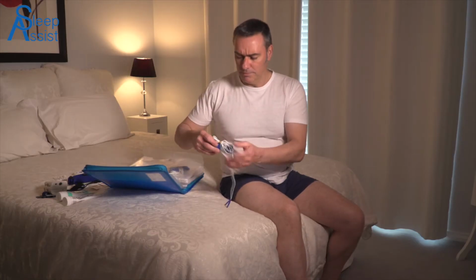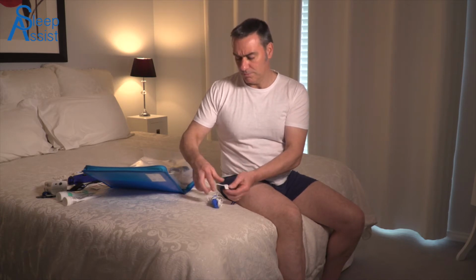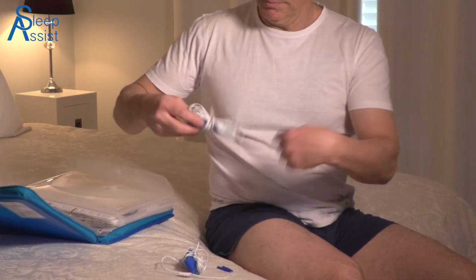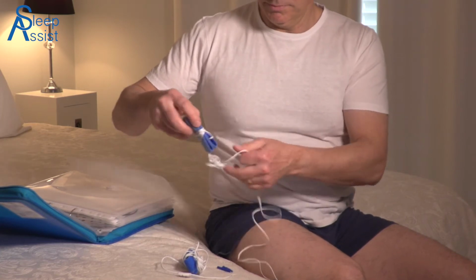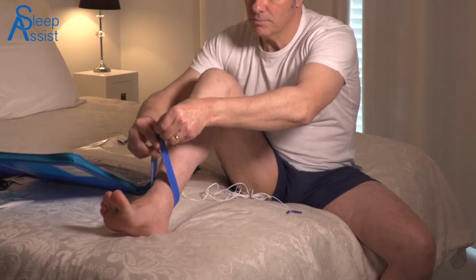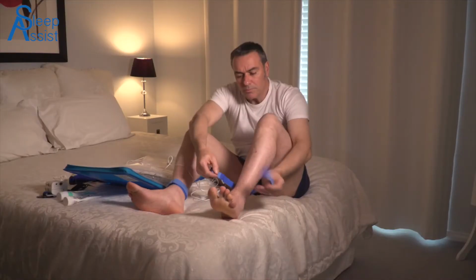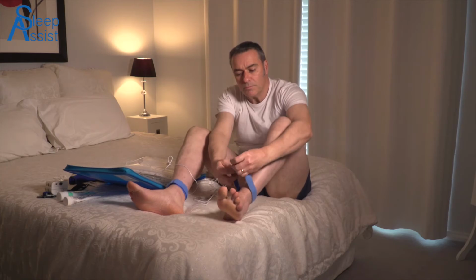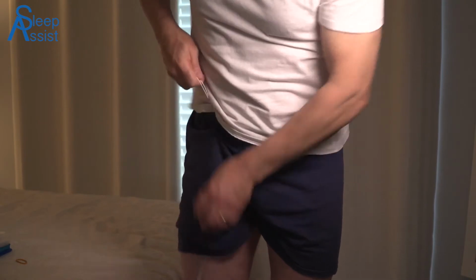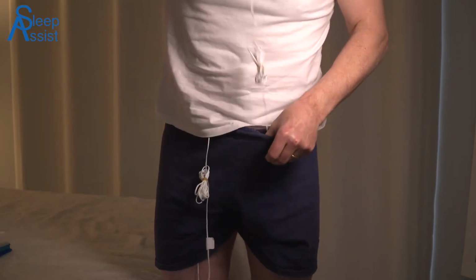Take the 2 blue material ankle straps and leads out. The leads will have a rubber band section bundled up to shorten the length as they are very long. Do not remove the rubber bands as these are necessary to prevent entanglement during sleep. Ensure the leads are hanging outside of your night garment, ready to be connected into the multi-lead port box.